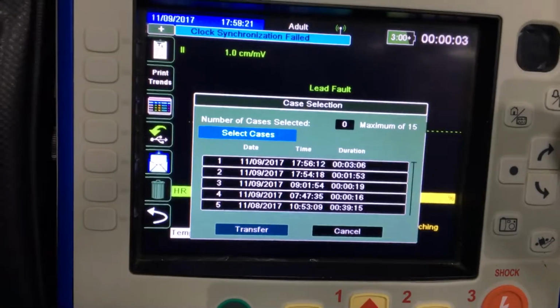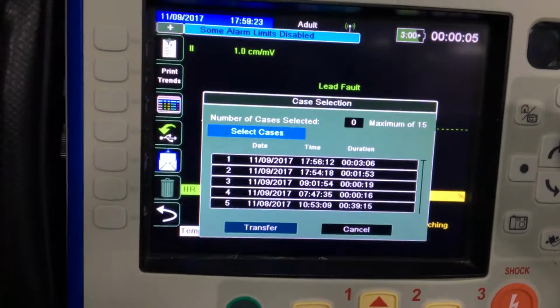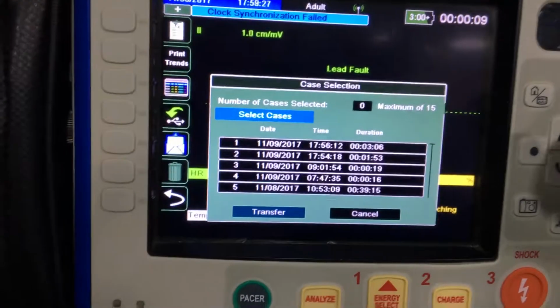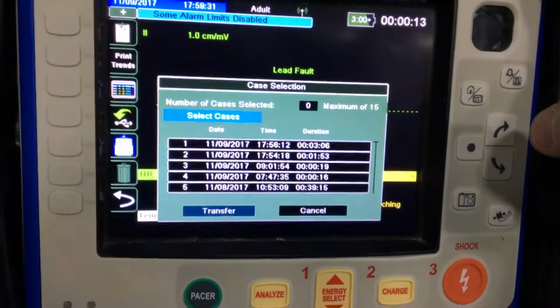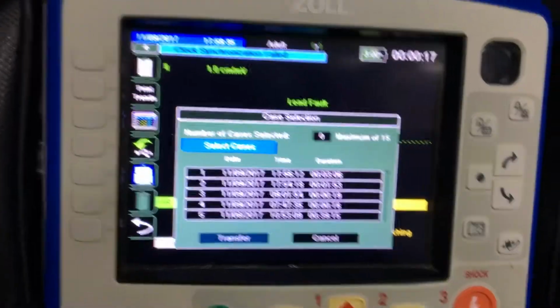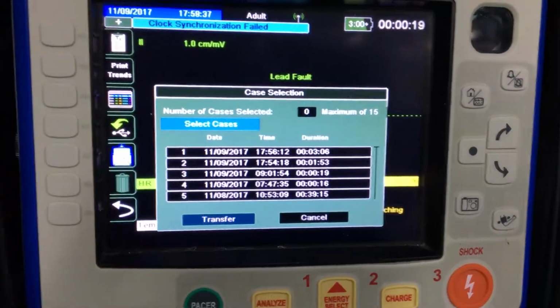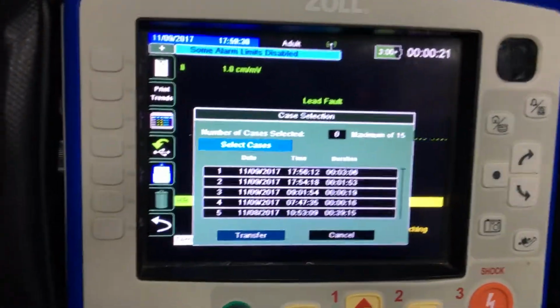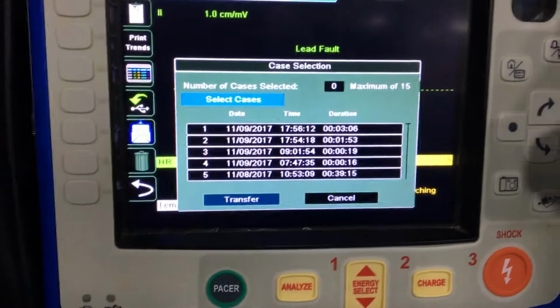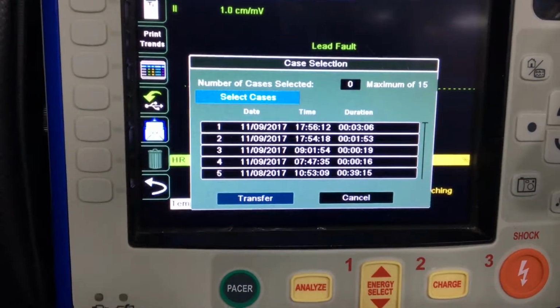So then you want to select a case. If you just finished your run, it's going to be the number 1. If you need to go back and get a different one, you have to be on that actual report somehow to do a different one. So pick the one you want.